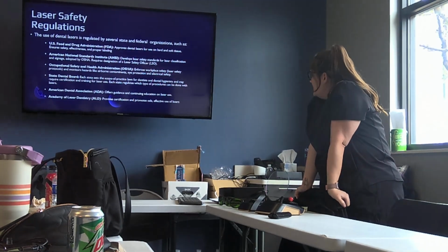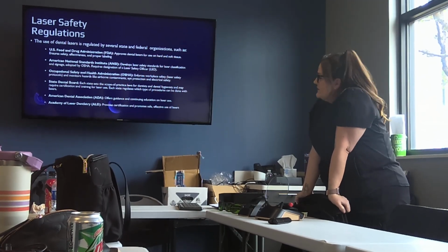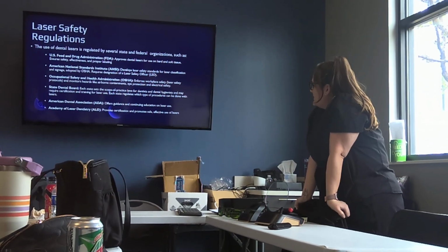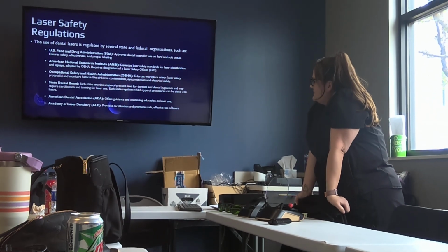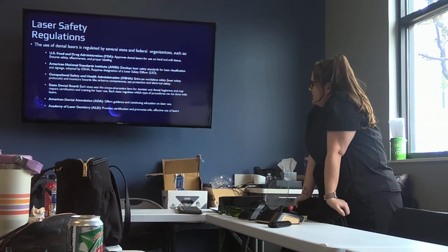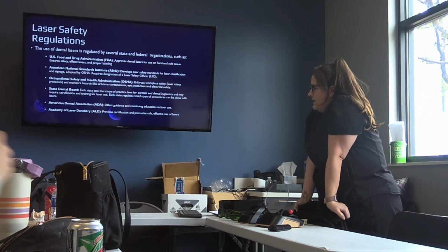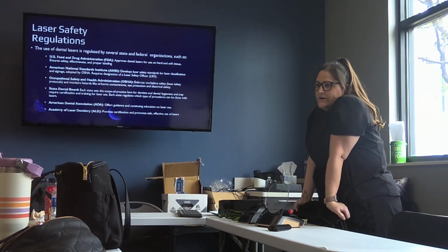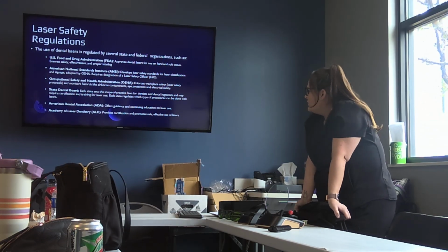But as far as lasers go, they enforce workplace safety, like the protocols set in place for the lasers. They monitor hazards like airborne contaminants. They mandate eye protection and electrical safety. And then again, each state dental board has their own requirements as far as what type of laser, who can use it, and to what extent.